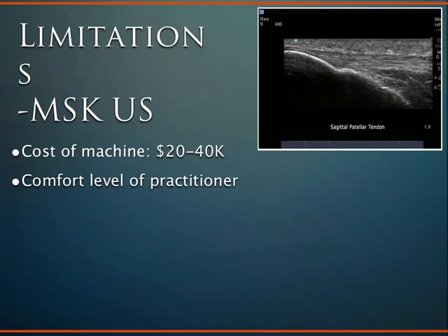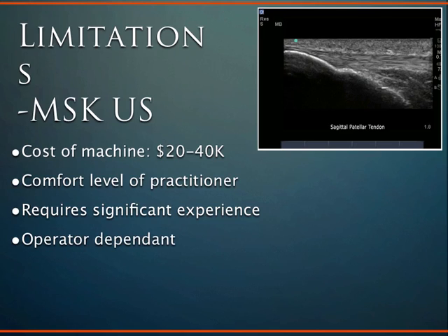Some of the other limitations, as I was alluding to initially, is that it really is practitioner dependent. If the practitioner isn't quite in control of their anatomy knowledge, or they're not quite experienced with the modality, it requires a lot of time and a lot of investment in terms of extra education, and so it is something that takes years to get comfortable with. And as I mentioned, I'm still working up to that. So it is very operator dependent.